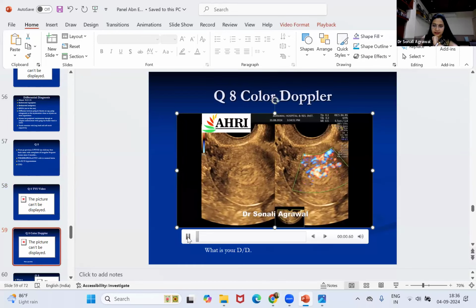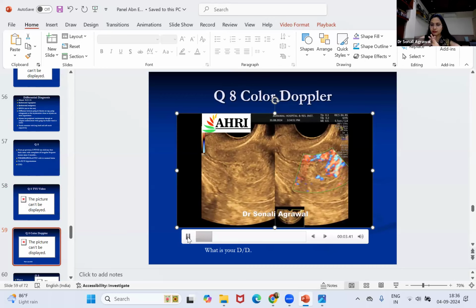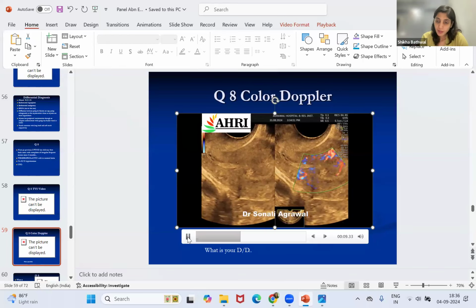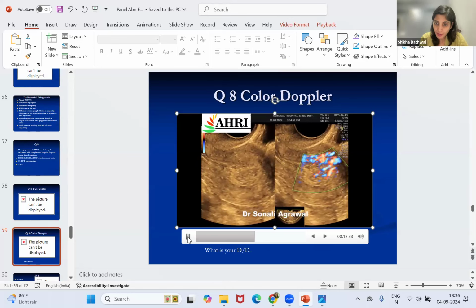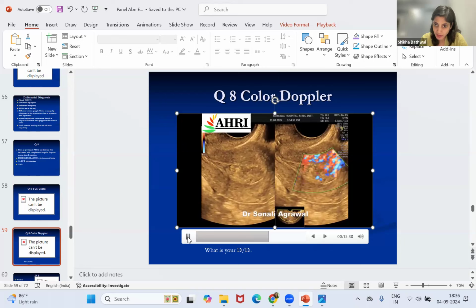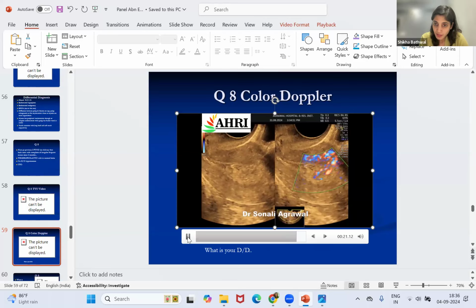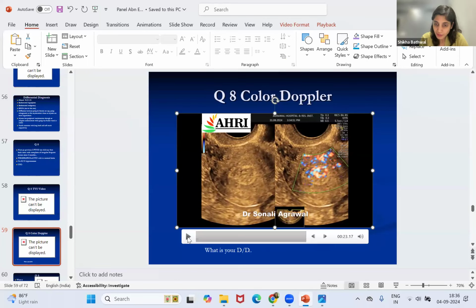And then she said, this is the color flow of this patient. Dr. Shikha? Yes, so on color flow, it looks like a color score 3 or 4, more towards 4, because the color flow is involving the endometrial area also. So this looks like a case of retained products of conception, but the chances of bleeding will be higher during the procedure. Even if we go for a hysteroscopy, the vascularity is high. It is a hypervascular RPOC. That's right. Hypervascular RPOC.